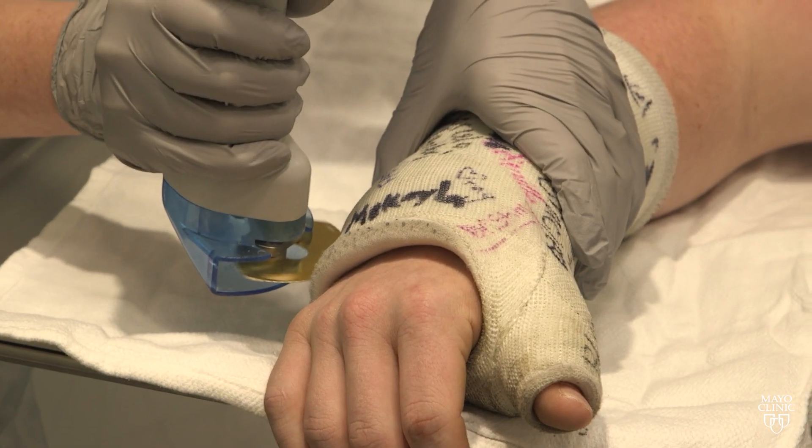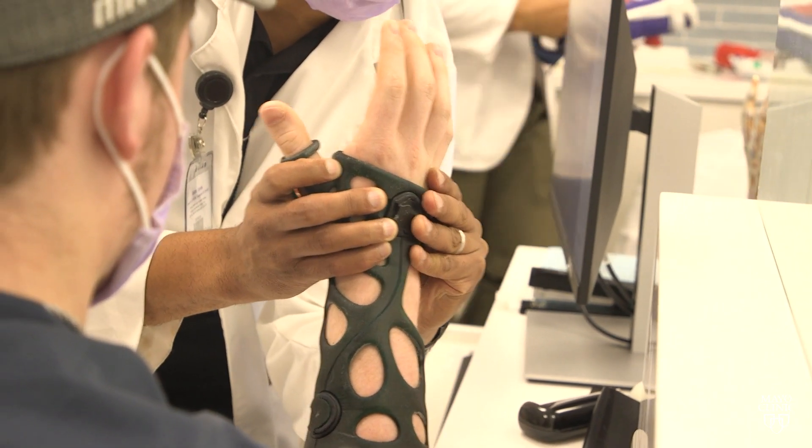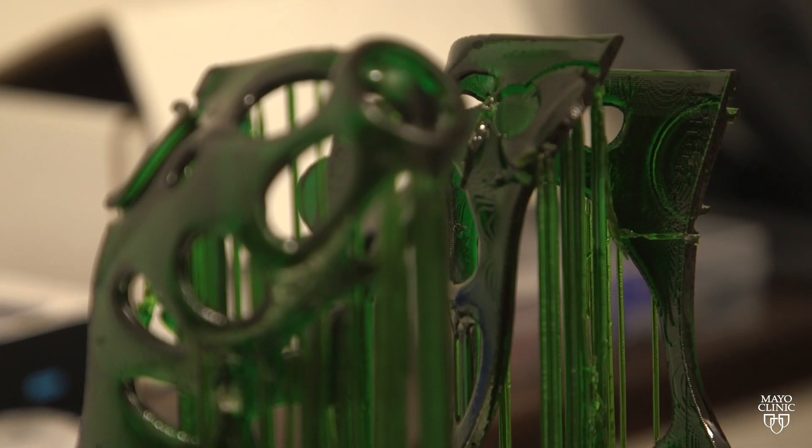Out with the old, in with a new, more hygienic way to heal, thanks to 3D printing technology. In about 90 minutes, a scan of the injured area is turned into a digital model, then printed using specialized equipment and supplies.